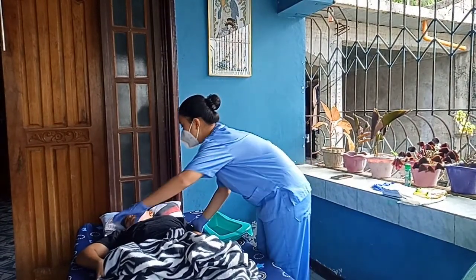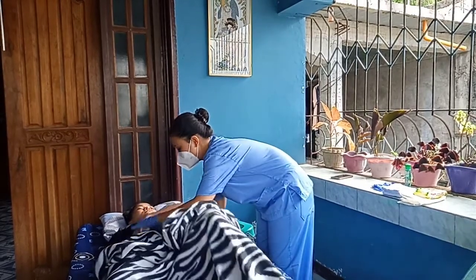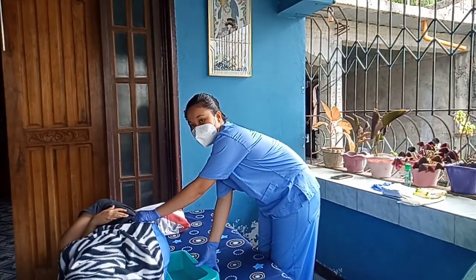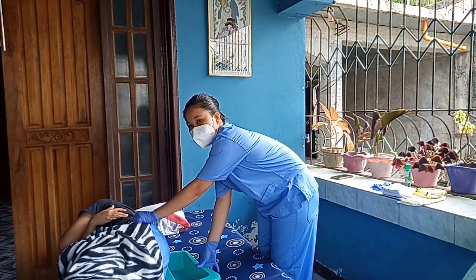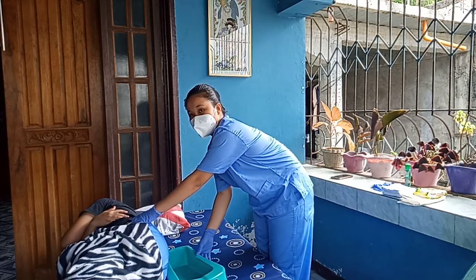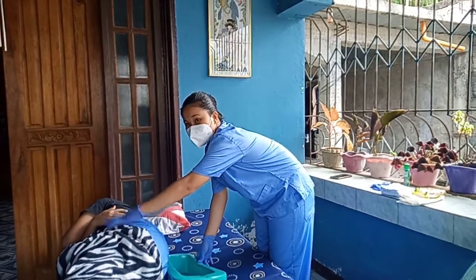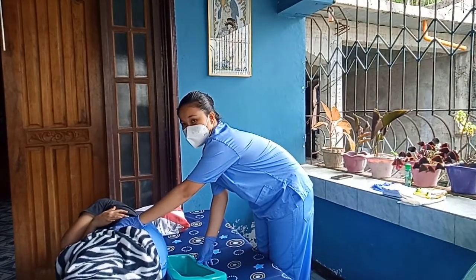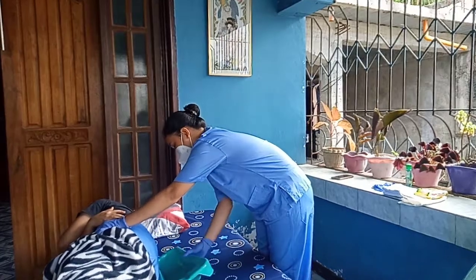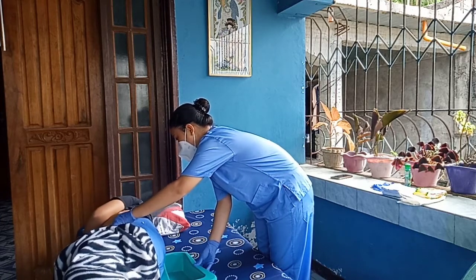Then, ma'am, I will move you on the side. So, 1, 2, 3. Place the bedpan on the buttocks and down into mattress. Then, ensure open rim faces foot of bed. Then next is keep one hand against bedpan and other around patient's far hip. Then ask patient to roll into bedpan. Do not force the pan under the patient. So, ma'am, I already put the bedpan, so you will now position on your proper position.